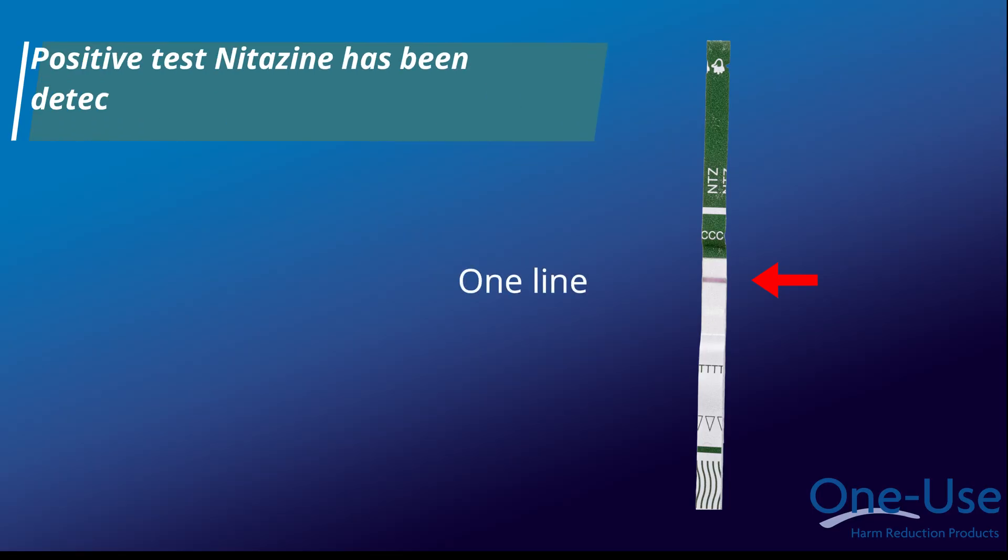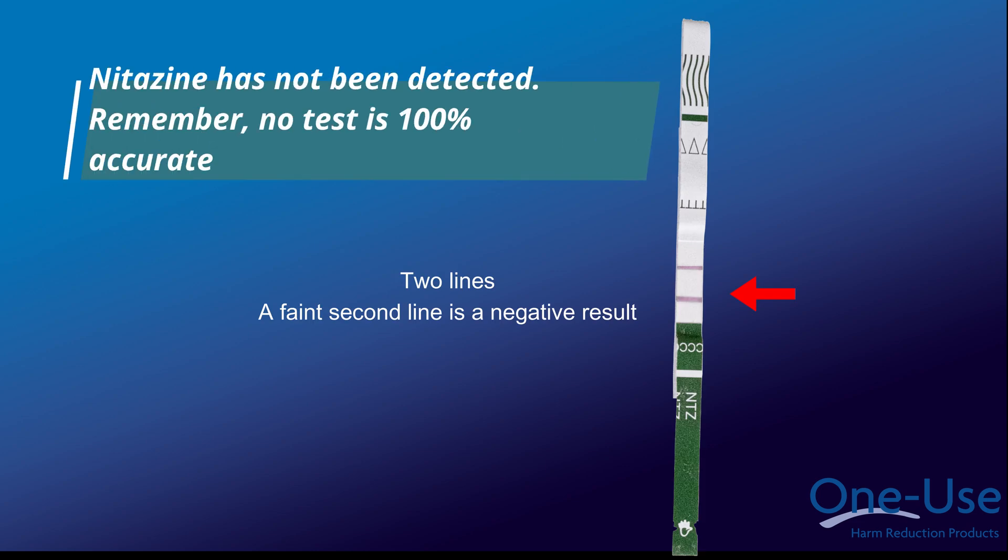This is an example of a positive test as the strip is showing one line. This means that nitazine has been detected. This is an example of a negative test. This means that nitazine has not been detected.